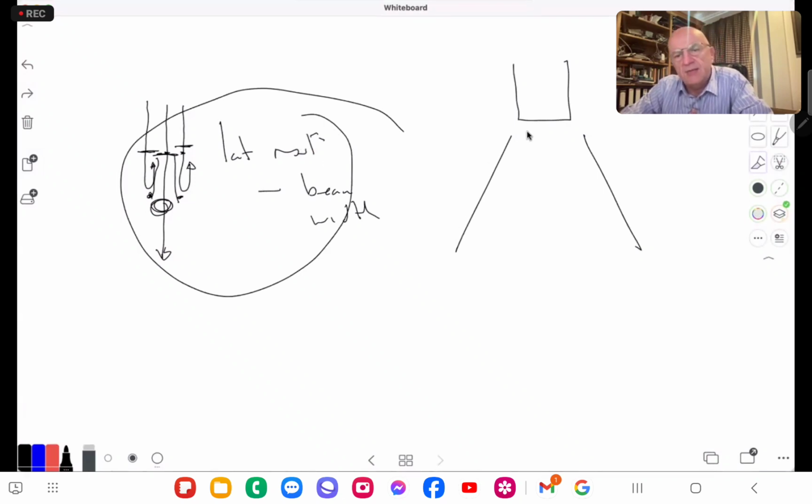When you think about taking your usual shaped picture of an echo like that, if you've got 40 beams here, what must happen to that beam as the sector gets wider? The beam gets wider, doesn't it? Like that.